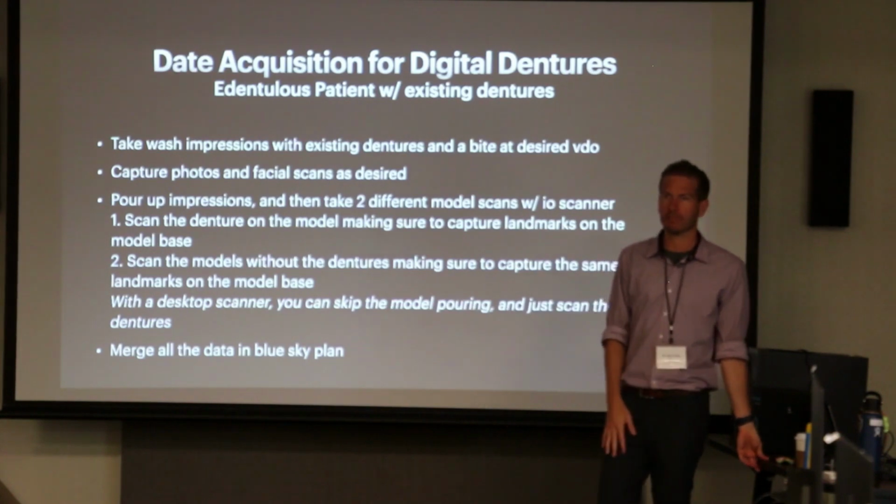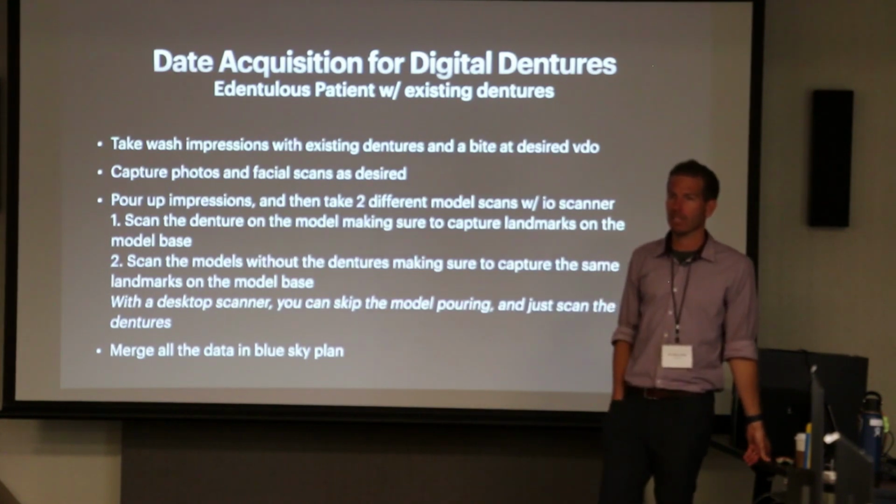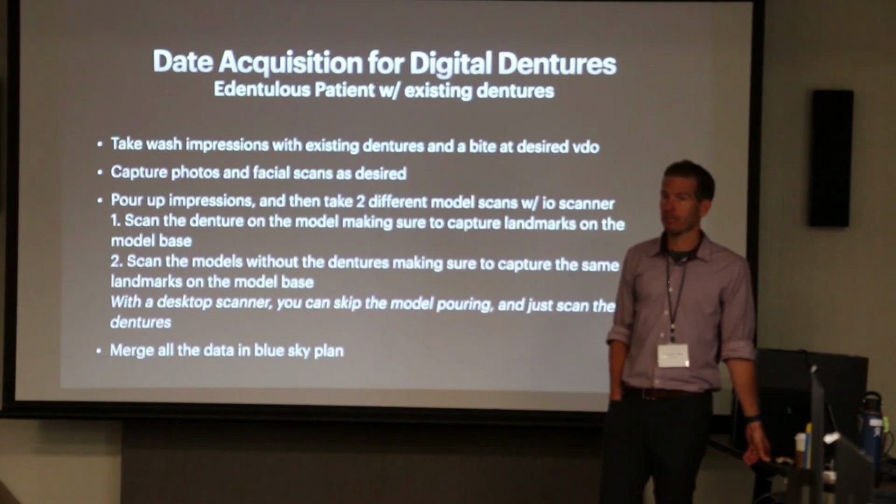Does that make sense? You should just be able to take an overextended VPS, and you have some of that overextension into the vestibule that will give you little defects and stuff. I'm assuming it'll work on the ray scan once we get it, but we should be able to scan that impression and click on those little points that have overflowed into the vestibule and stitch that somehow.